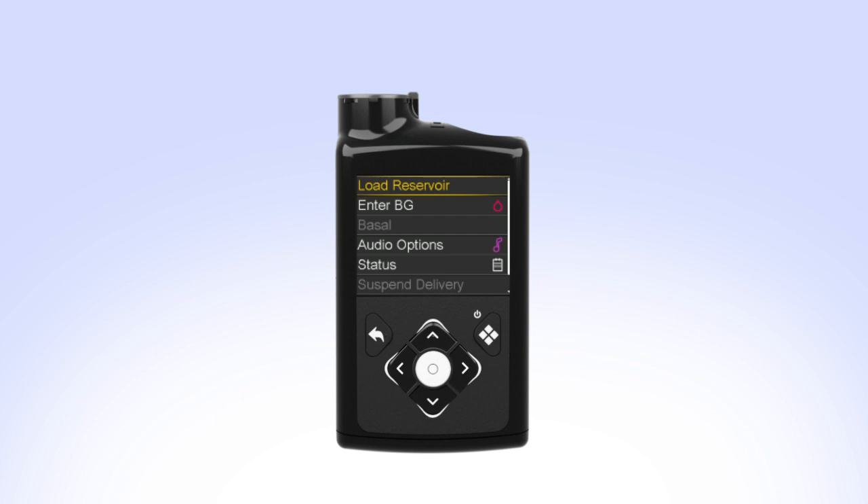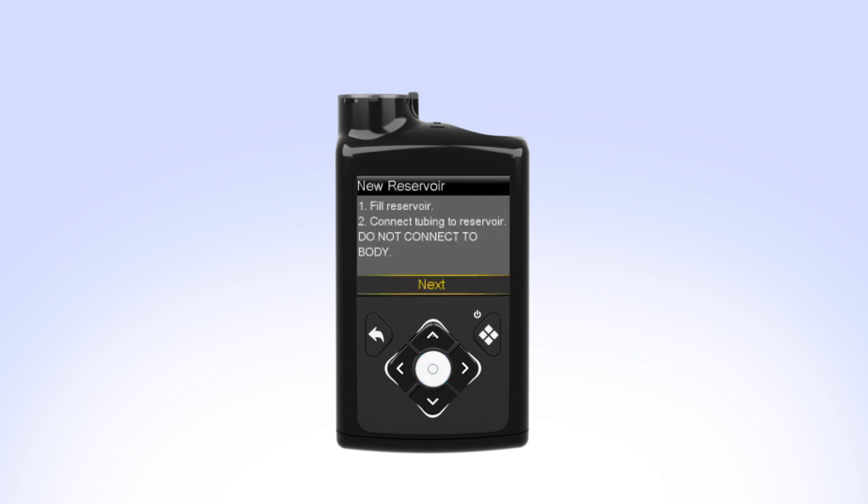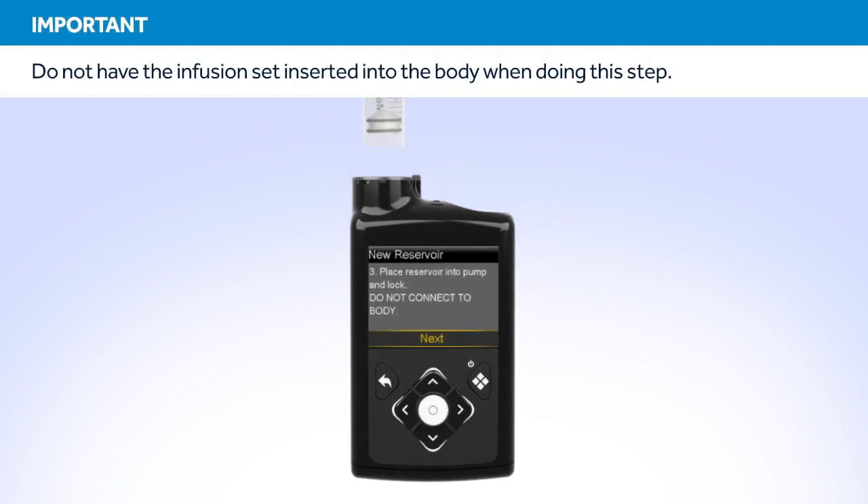Select Load Reservoir from the menu. The new reservoir screen appears. Since you have already filled the reservoir and connected the tubing, select Next. Put the reservoir in the pump and turn the tubing connector clockwise until you feel the reservoir lock into place.